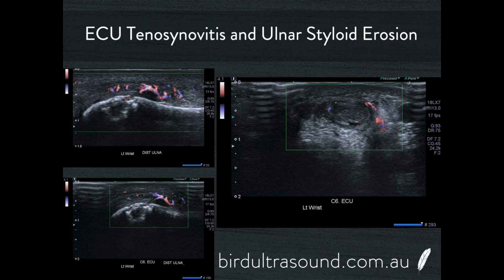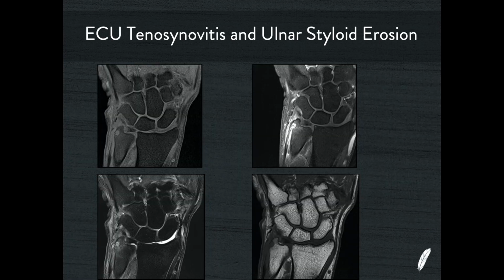The last thing I want to touch on is ECU, so extensor compartment 6, extensor carpi ulnaris tenosynovitis. It's a very easy diagnosis to make, but next time you make it, have a look at the ulnar styloid and look for any erosive process, because these erosions that we get in the ulnar styloid are a really early and really sensitive marker for rheumatoid arthritis, and they may also be associated with gout.